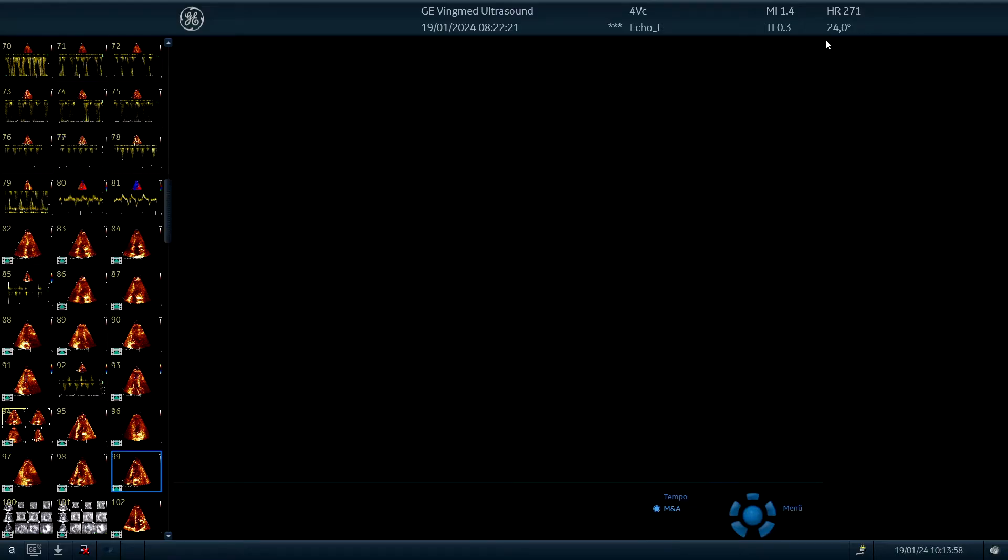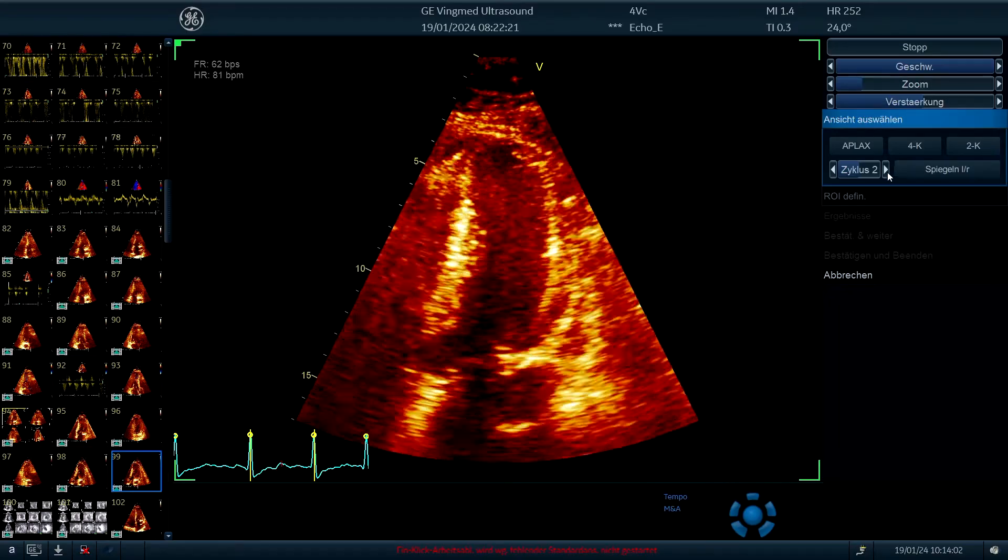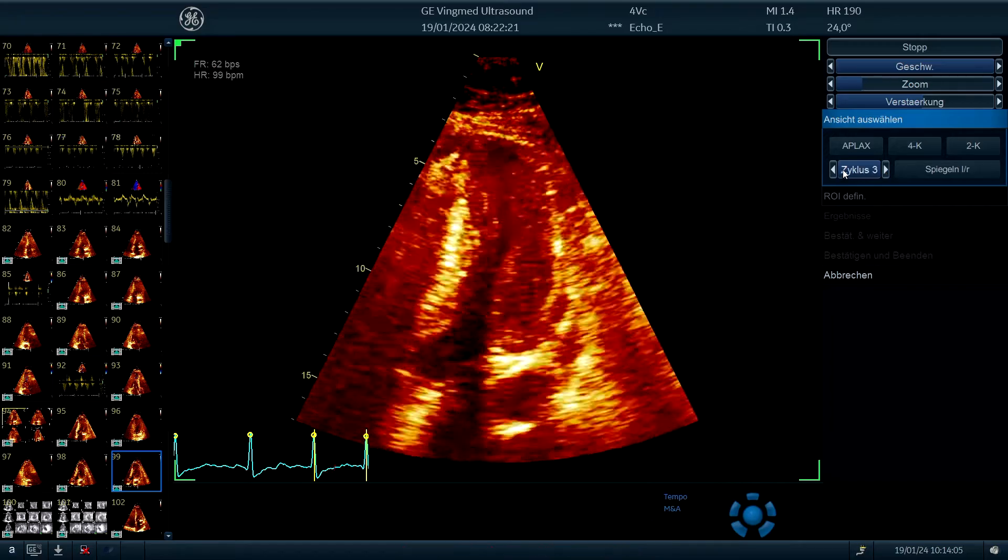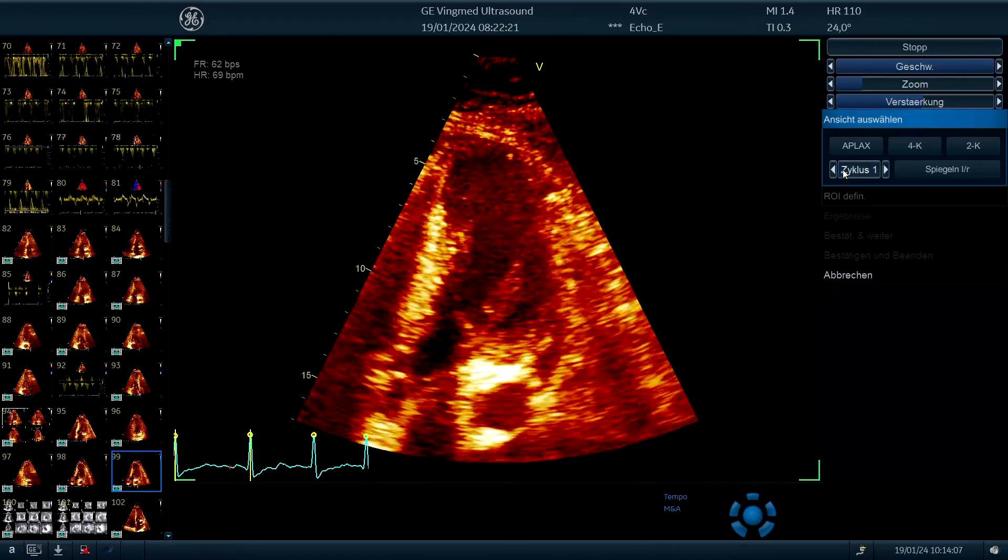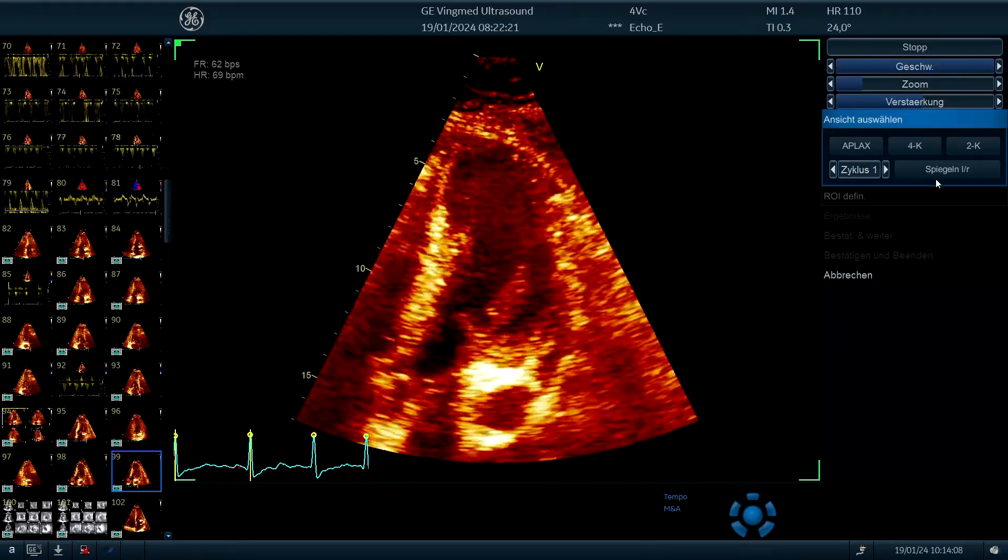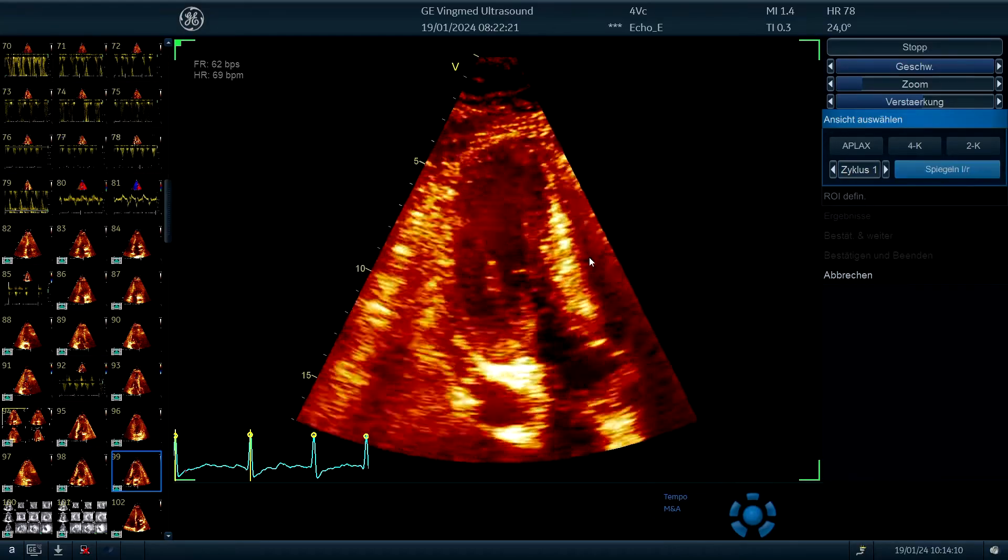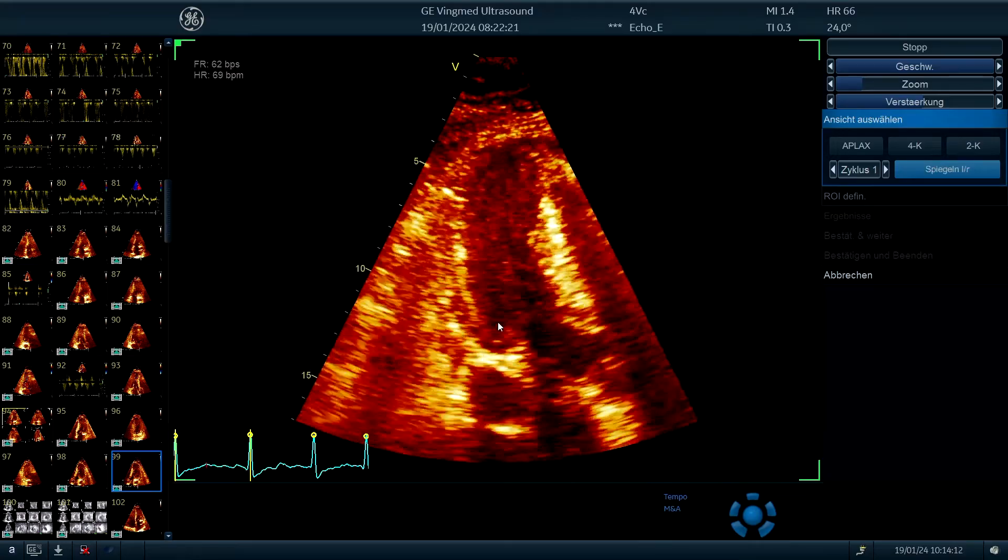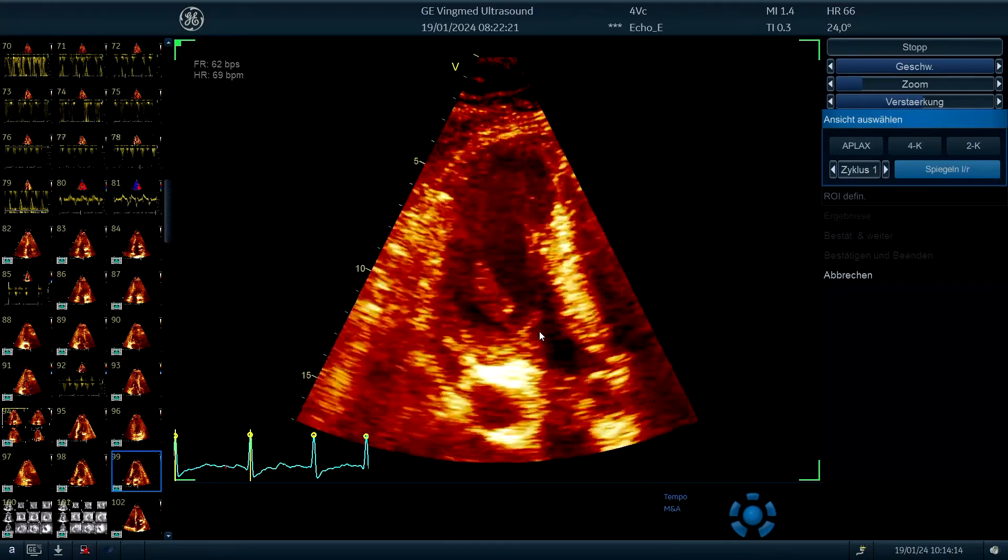We have here our signal and we take the first one and we do a mirror image and now we have the same walls as we have in the apical long axis view.